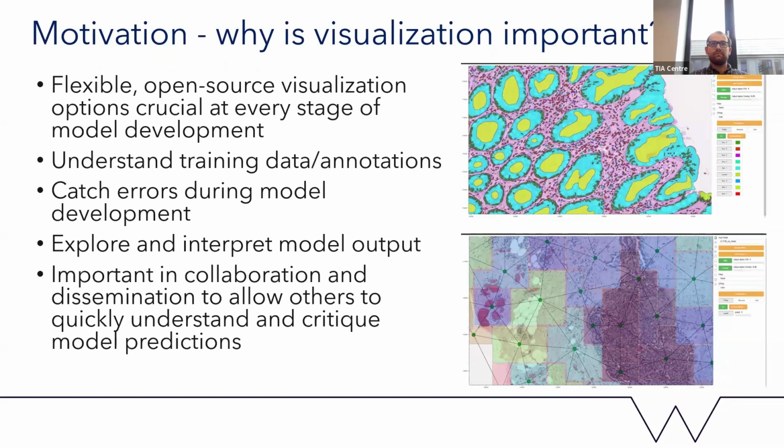So first of all, why is visualization important? When you're developing models, it's crucial that you have flexible open source visualization for every stage of the model development, because you want to be able to understand the annotations and the data that you're training on. You want to be able to see the annotations overlaid on the slides and explore those. You want to be able to visualize also at intermediate stages of the model development. It's often the case that you can catch errors during model development that aren't necessarily obvious in the code, but that become obvious when you visualize various aspects of what your model is doing.